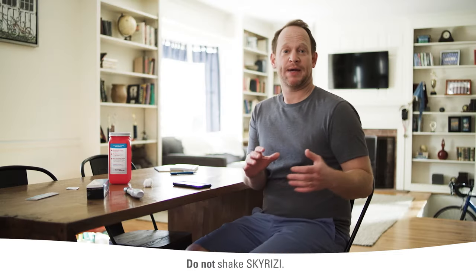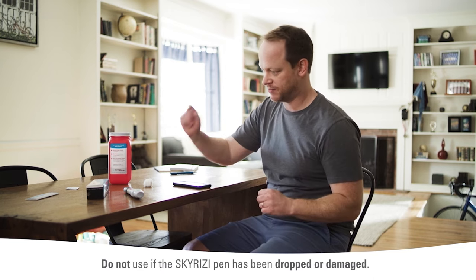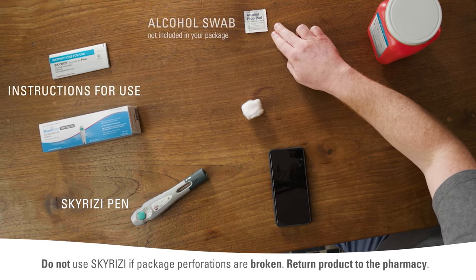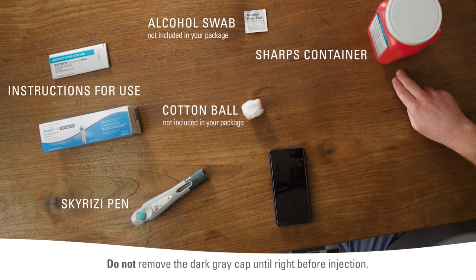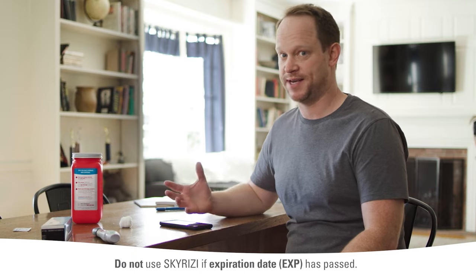Now that I've washed and dried my hands, I'm good to go. I take out everything I need: my Skyrizi pen, the instructions for use for reference, an alcohol swab, a cotton ball, and my sharps container. I do my injections here because there's just plenty of light and a lot of good space.